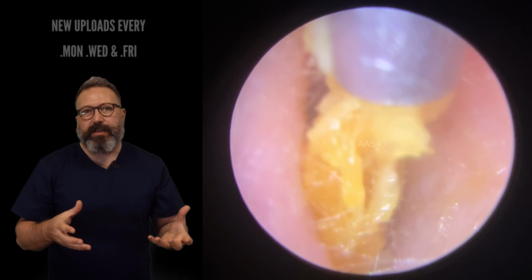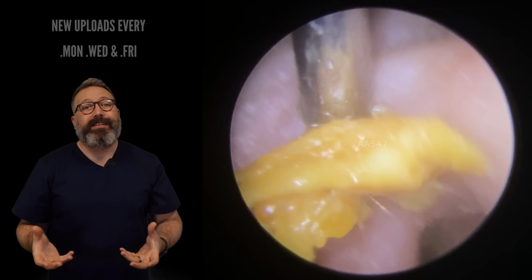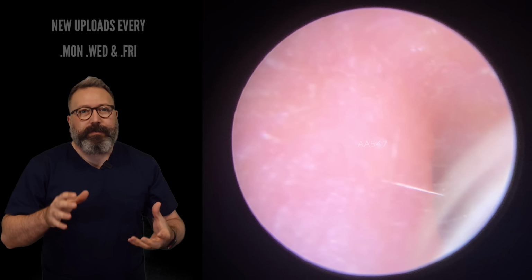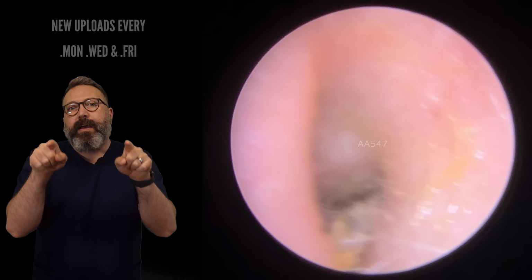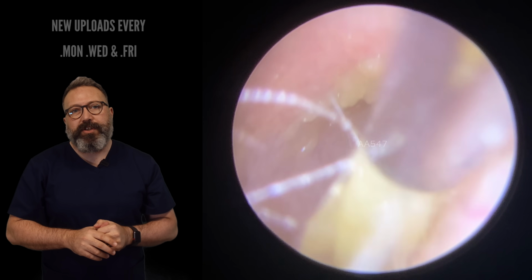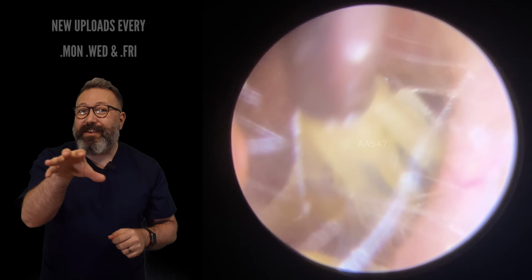Now when we get this neck section, this is a little bit of wax that's got stuck behind that skin, so you can see it's coming away, little bits of skin now getting sucked in from the outside edge. But as we get this piece out, there we go, and get rid of that bit as well. When we take a look in, see that little lighter coloured ridge you can see just at the top of the canal wall. Now that's where it detached, so you can see it started from that point. So we're just going to take this piece of skin. Watch how this peels away. This is the surface layer of skin we're talking about.